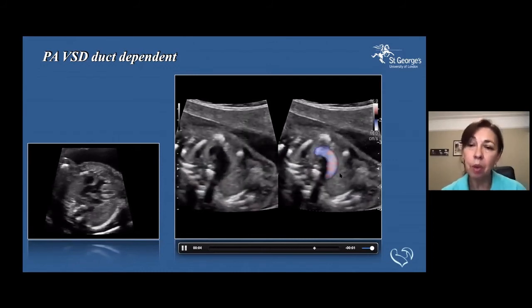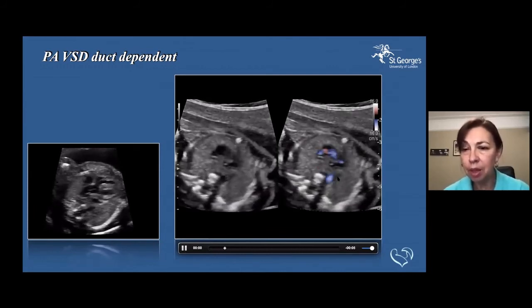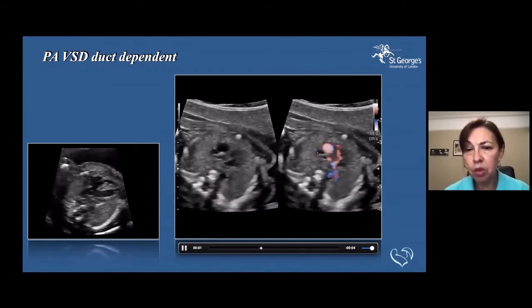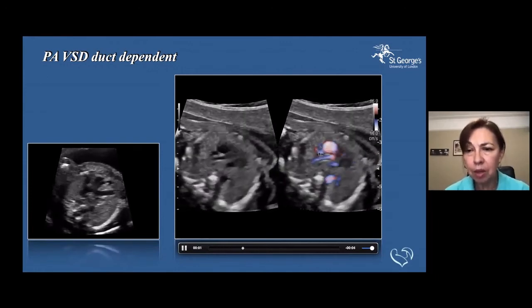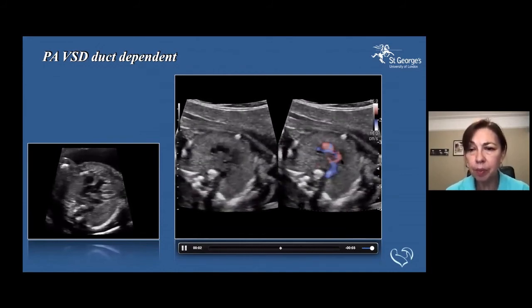And that helps in counseling the patient and knowing what to do with the baby. For example, in this case, you would do either a stent of the arterial duct or a shunt operation in the first few days of life. So some of these details are very clear, very important. We also see a little bit of the azygos vein coming here, just as a flash, that pink shear coming to the SVC.